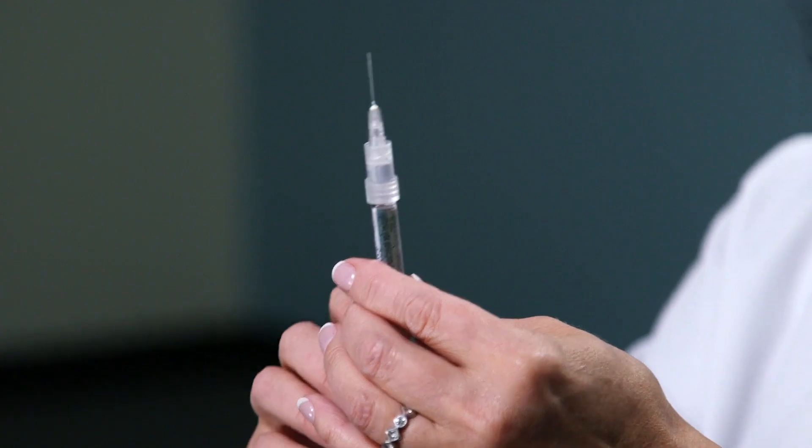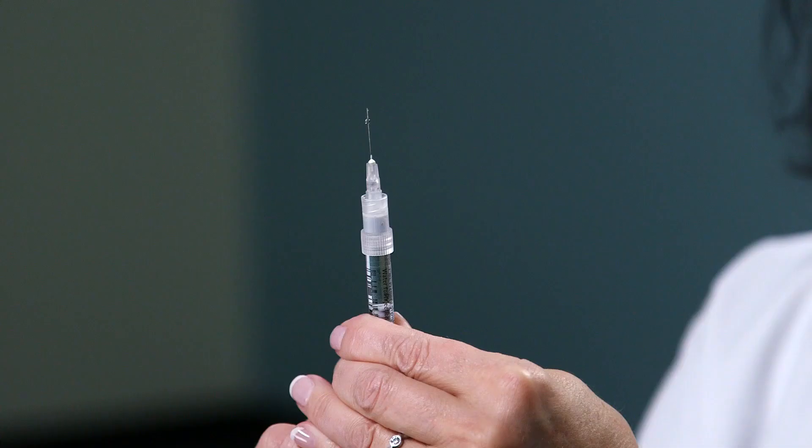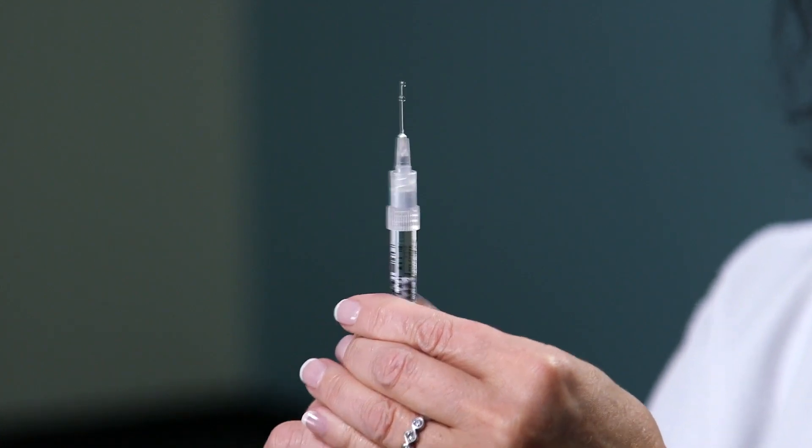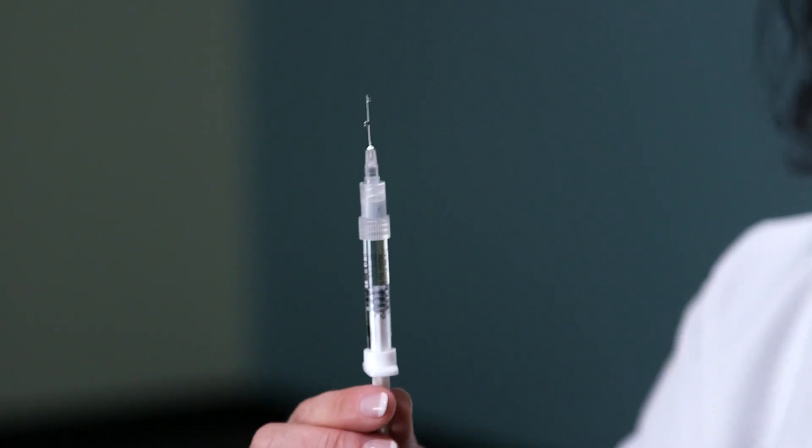Tap any bubbles in the syringe to rise to the top. Press on the plunger gently until you see a droplet form at the tip of the needle. You are now ready for your subcutaneous injection.